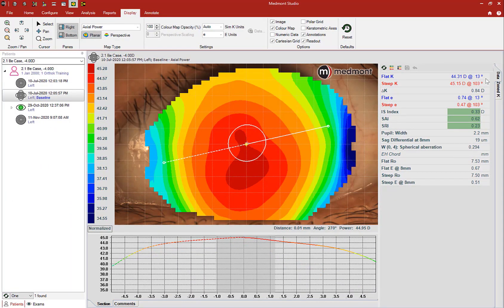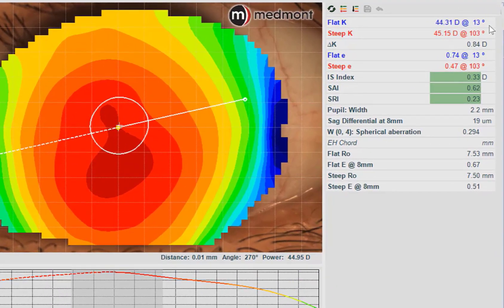Let's finish with an orthokeratology case. The K readings show the cornea is a little on the steep side. Research has shown that orthokeratology tends to work easier on steeper eyes rather than flatter eyes, so this patient appears to be a good candidate. The corneal astigmatism is relatively low, again making this a good ortho-K candidate. When we go down to eccentricity, we know higher eccentricity eyes tend to respond better to orthokeratology. This patient has a higher than average eccentricity — the median on Medmont is about 0.65 — so in eccentricity, this patient also appears to be a good candidate.